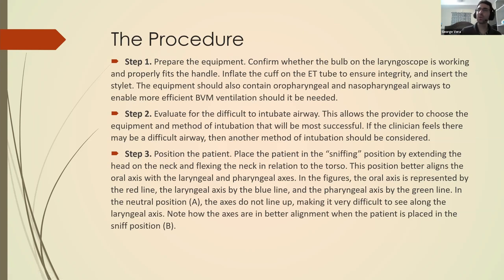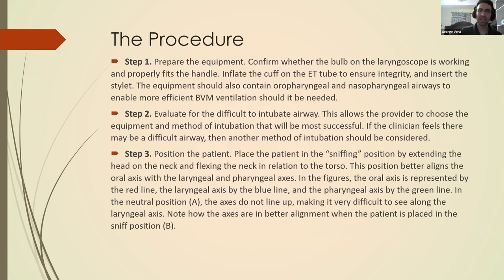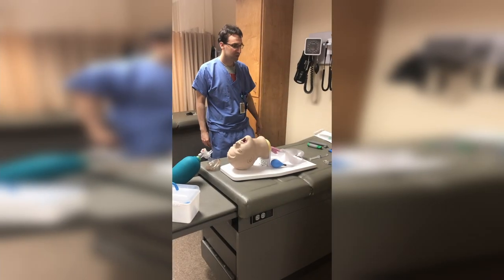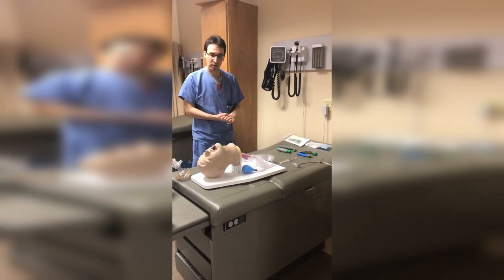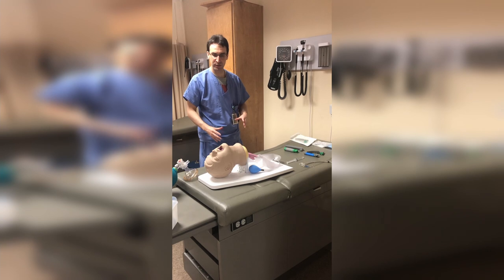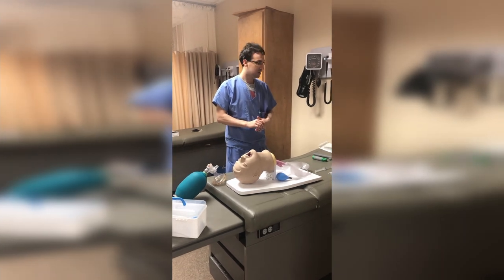Lastly, this is the procedure that I'll be following during the demonstration, taken directly from your textbook, which is why some steps allude to certain video figures and tables. I will be trying to follow this as closely as possible. In front of you, I have laid out all of the equipment we will be using for the endotracheal intubation. We'll start by discussing specific pieces of equipment, then work rightwards toward the model, and I'll discuss how to use the bag valve mask.